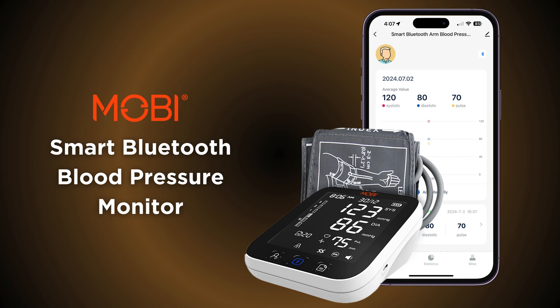Hello, in this video, I will demonstrate how to set up your Mobi Smart Bluetooth Blood Pressure Monitor.